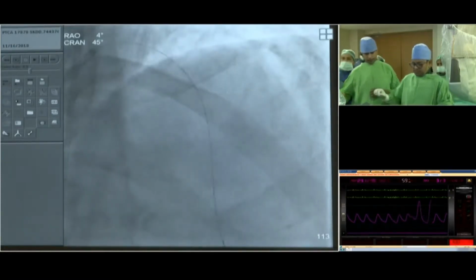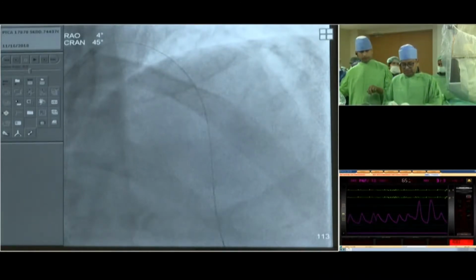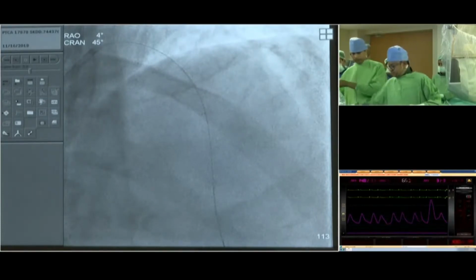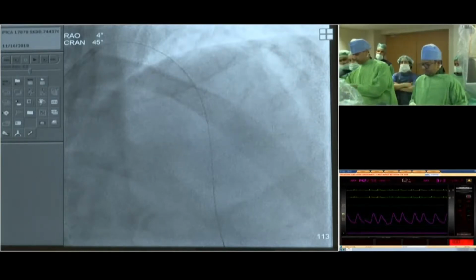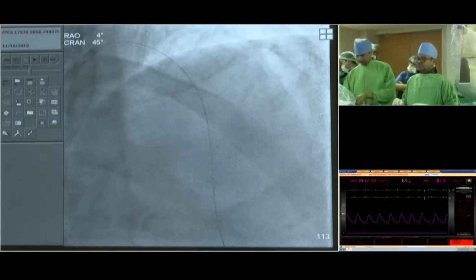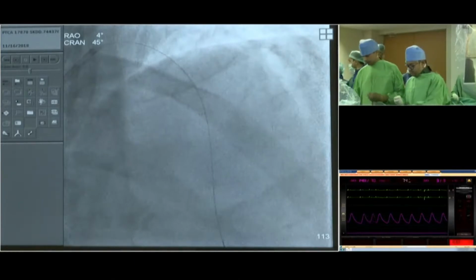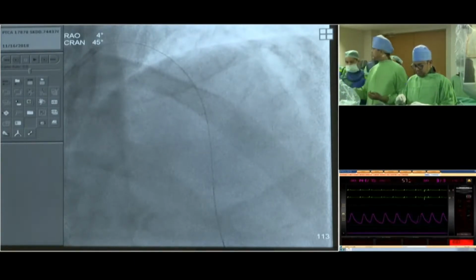We'll do an OCT and check. So we'll do OCT imaging and then see whether we need to go up. How many of you feel that we should do 3.5 millimeter dilatation beforehand? We'd like to do a 3.5 dilatation in the proximal part of the stent. Raise your hands. Yeah, very, very few people. So let's do an imaging and then see if this is required. 3.5 is probably reasonable, 3.25 at least. The OCT will tell us.